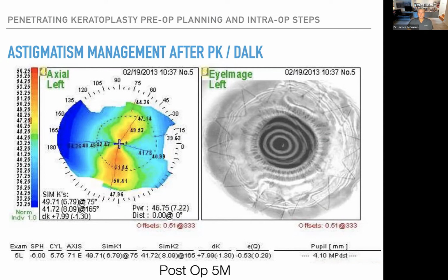So now you can see in this photo that the axis of astigmatism is around 75, and it has 8 diopters, which is not uncommon. And then you look on the picture of the Mires, and you see some interrupted sutures in that area. So I would remove those interrupted sutures, knowing that I have that running suture there for added safety. So if you're doing interrupted sutures, you're going to wait at least 6 to 9 months to remove sutures. And you can't remove adjacent sutures.